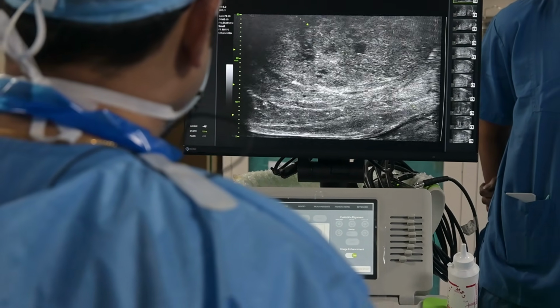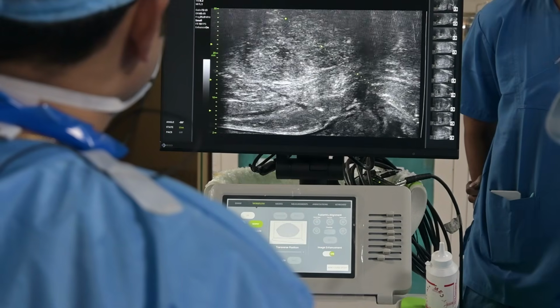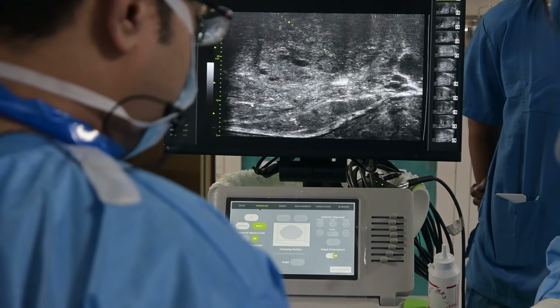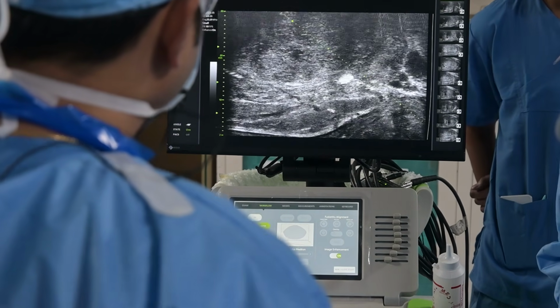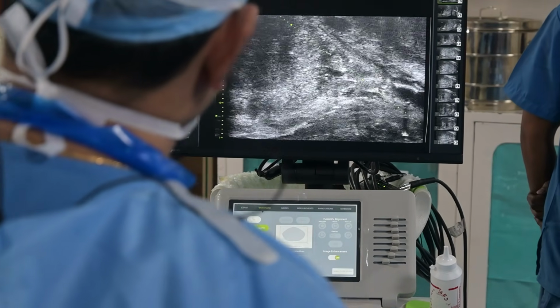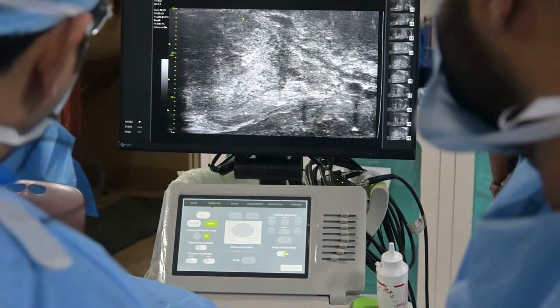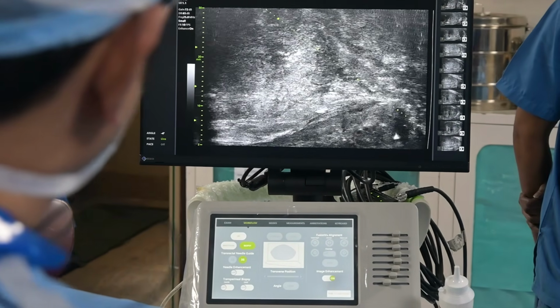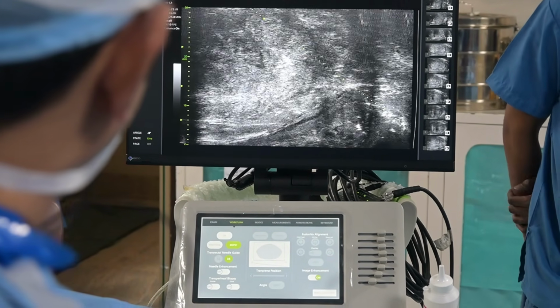So, sir, this was my apex medial, and now this is my apex lateral. When I come to the auditorium in the lecture, sir, I can show you the patterns. Sir, another thing is that when we want to target the anterior zone, so this is the apex. I compress the gland and then I can swirl and go to the anterior side, like in any of our other machines. And anterior lesions can also be perfectly targeted.